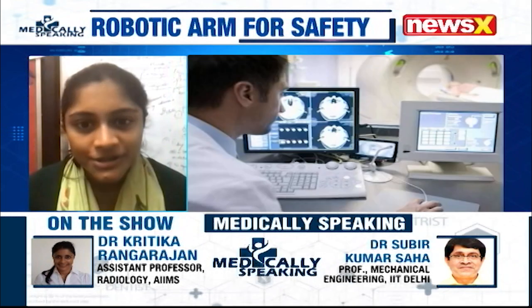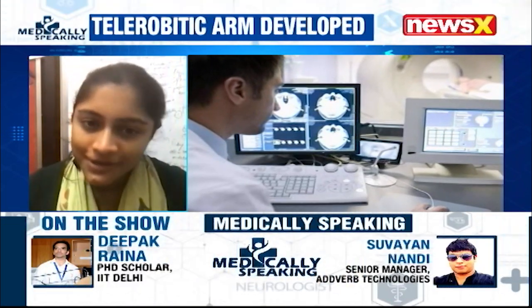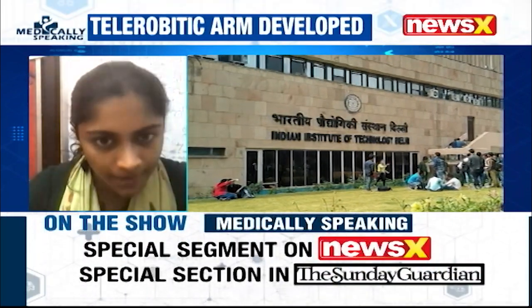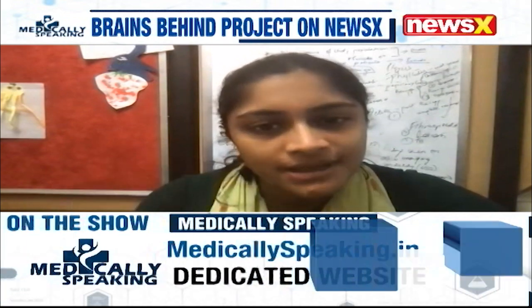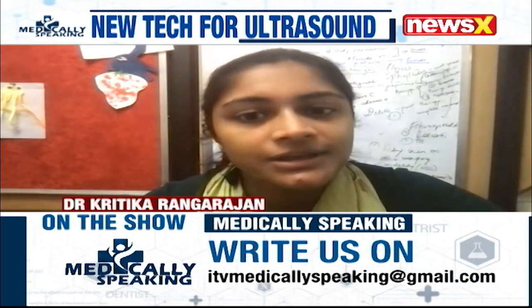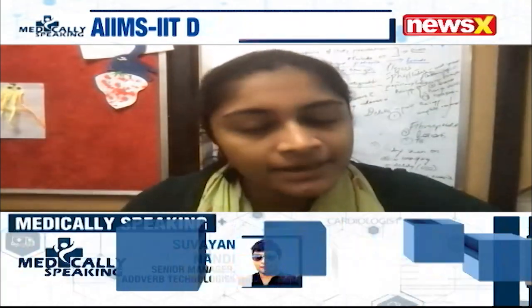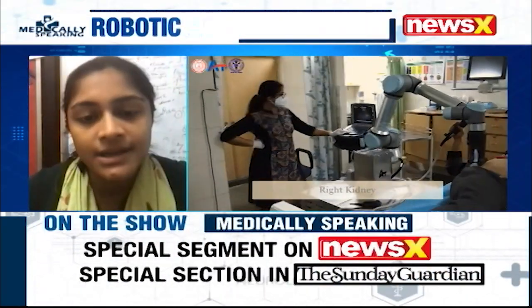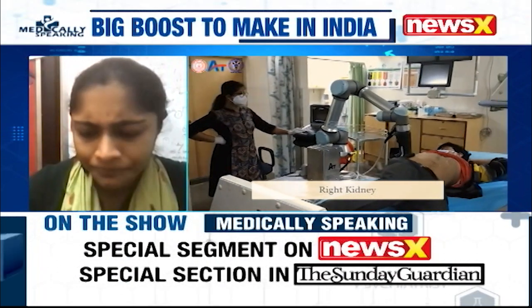Like it was just mentioned, we thought of this primarily in the context of COVID. Although the thought has come to us several times in the past as well, in relation to distance ultrasound, particularly in a country like India, where a large part of the population lives in rural settings and does not have access to healthcare. For ultrasound, who does the ultrasound is a very important component. A CT and an MR is done by a technician and can be interpreted by an expert who does not need to be at the site, unlike an ultrasound which needs to be operated by an expert.